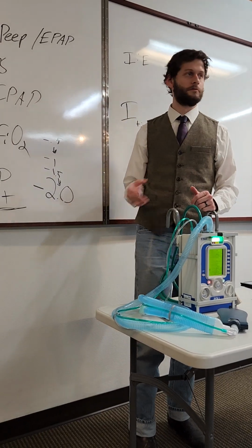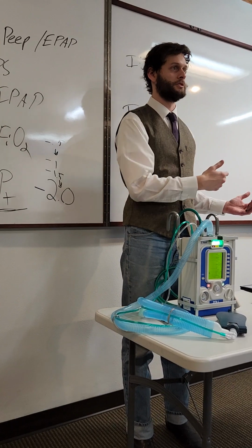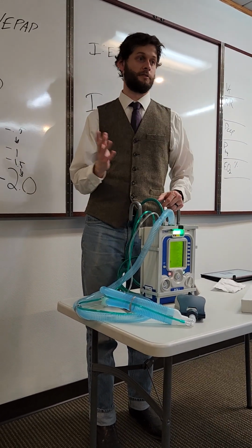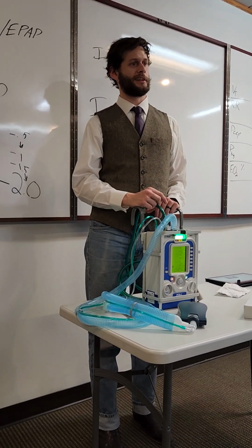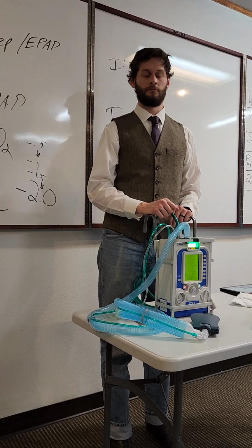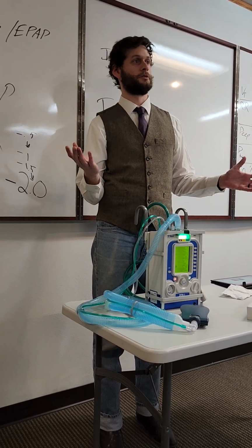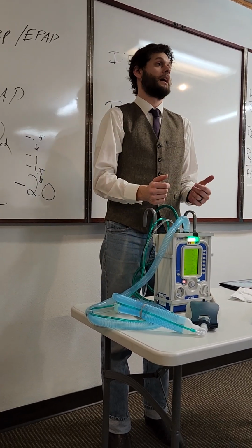So leaving the trigger at 2 for most of your intubated sedated patients, absolutely fine. No problem with that. However, there are going to be weird cases where they're in ACMV, but they're breathing at 36 and it's set to 20. Well, in that instance, maybe I turn the trigger down just a little bit, so the patient can get those breaths that they're used to having at this point.